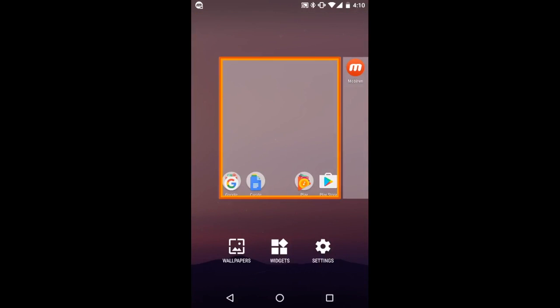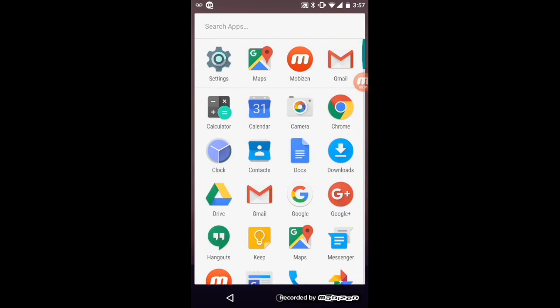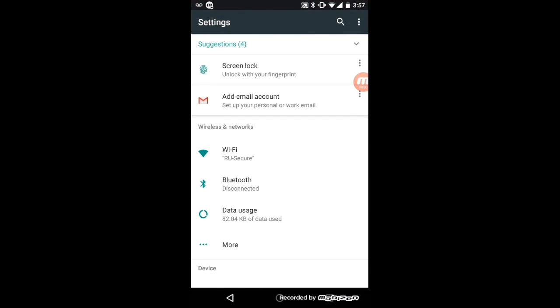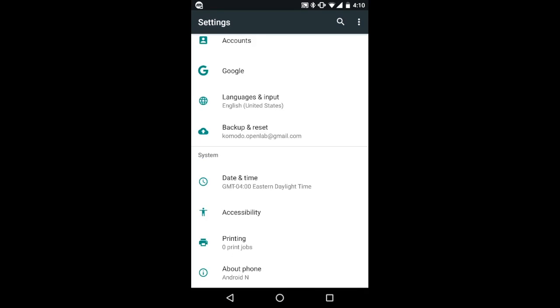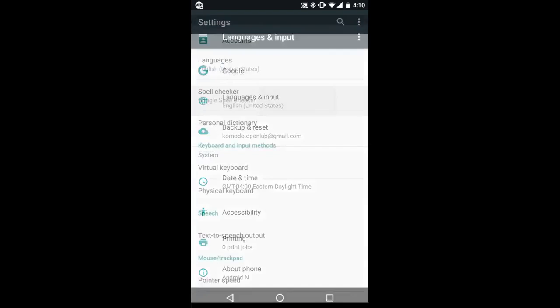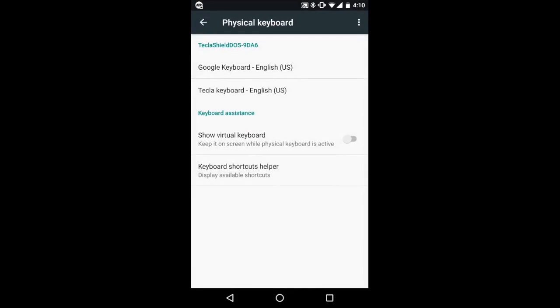Before turning switch access on, you need to ensure that the on-screen keyboard is shown. For this, go to the settings menu, and under language and input, select physical keyboard, and enable the item show virtual keyboard.